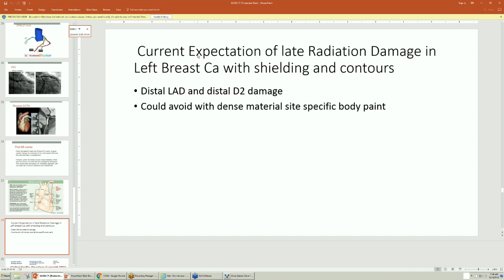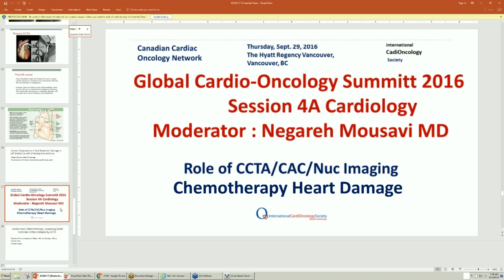So you can have somebody that you're doing a CT on for lung cancer screening, and you get the CT and you gate it, and you get the heart as well as the lungs. We get the lungs as well as the heart, whichever you're focused on. And so you get that heart, and you can score the calcium on the heart as well as look for cancer of the lung. But you can't, because there's no way of charging for it. So if you don't charge for it, you can't do it. That's unfortunate, because you can't get two for one. So you have to sort of do that under the radar if you want to really get some observational information.